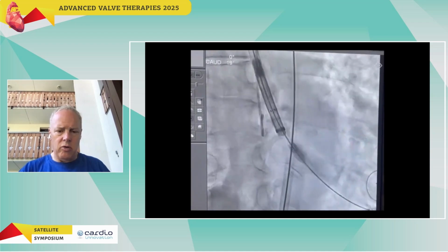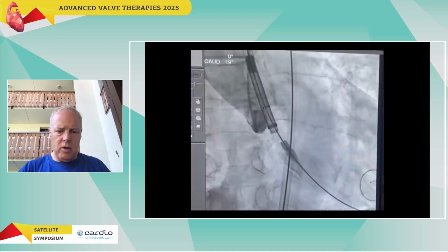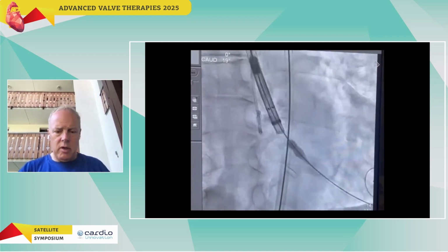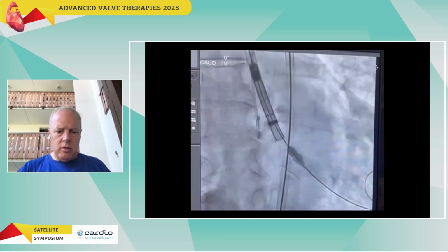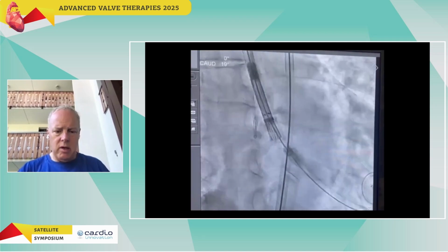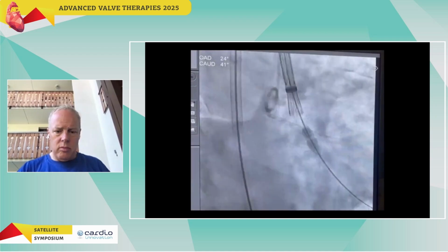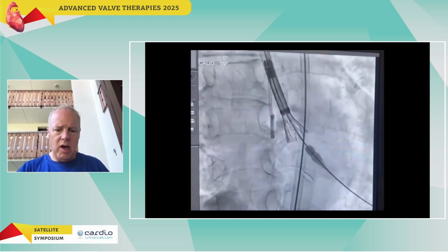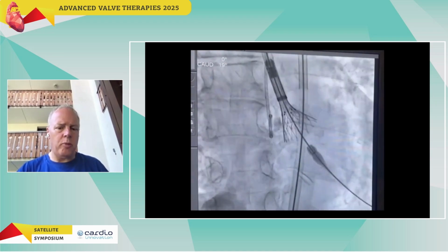We came to learn that you can go a little bit quicker than this. So slowly unsheathing the valve and checking the position up to the gold markers. And we're aiming for 2 or 3 millimeters below the base of the non-coronary cusp. So you can still see the gold markers separating, which does help you with commissural alignment, and that's a technique that obviously we can describe later. When everybody's happy, we start rapid pacing, and then he opens up to the safety lock position. He actually goes fairly slowly here, but we discovered that you could go quicker as the trial went on. You can see it's very, very stable as it opens. There's no diving in.